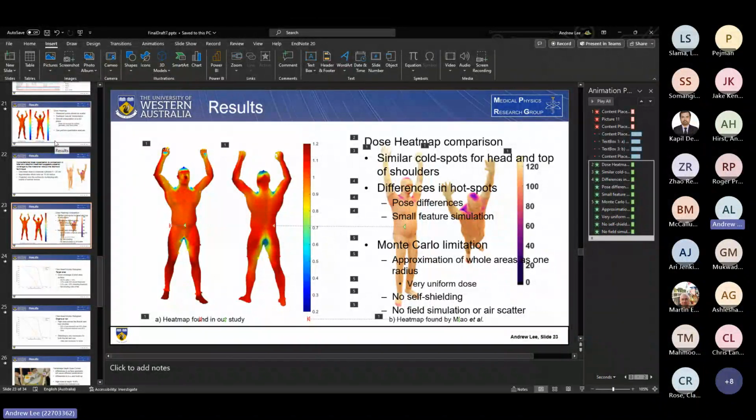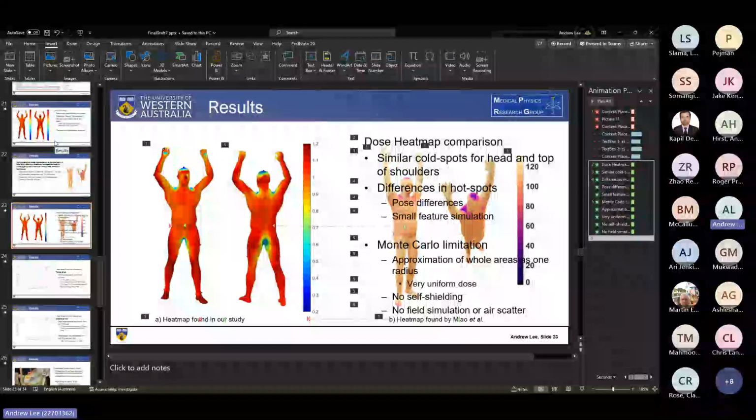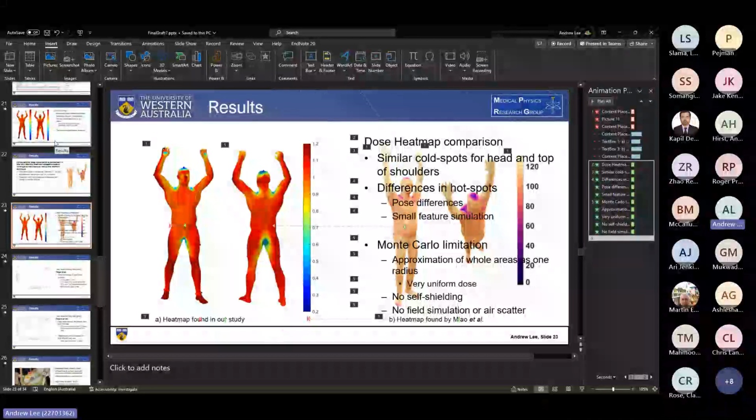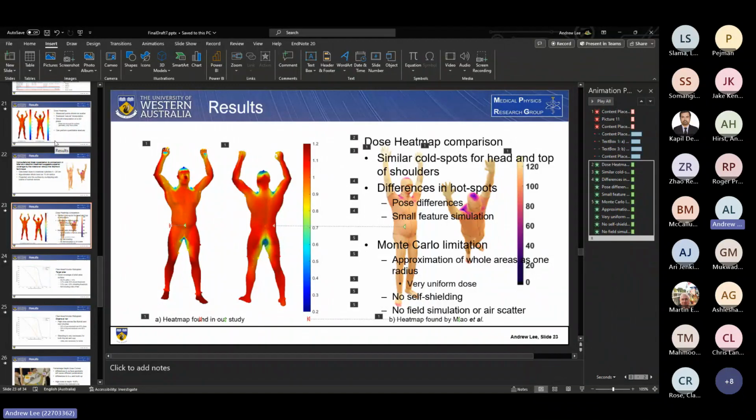In the guidelines, it's specified that the dose to the actual eye should be less than 0.7 grays. And so for that margin, you can still see some symptoms. For this treatment, it's considered acceptable still. It does reduce it to below that amount in standard procedures. There's other areas as well, which they... Sorry, I've lost my track. Does that answer the question?